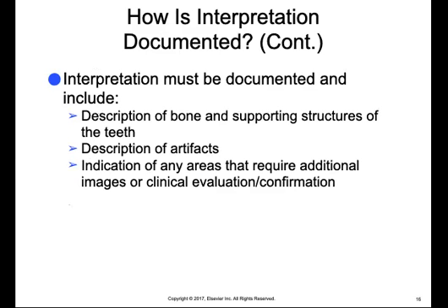So interpretation must be documented, and it has to include the description of bone and supporting structures of the teeth, the description of artifacts, and any indication of any areas that require additional images or clinical evaluation or confirmation.